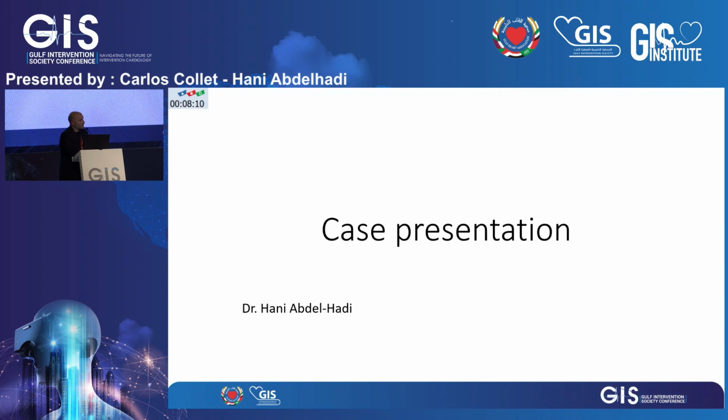People who have no experience of DCB, it's difficult for them to talk about it because they've maybe seen it or heard about it. But if you've done this on your patients, especially the diffuse atherosclerosis you've spoken about, and you've seen the results in 3 months, this is my immediate outcome: the angina is resolving, at least in my follow-up patients. I'm just talking about CCS. So maybe, I'm not saying this is the answer, I'm saying maybe this is a better answer for diffuse disease. We should not say intervention is not the answer for diffuse disease. Maybe the DES is not the answer. I'm just provoking thoughts, because this is what I've seen, at least in my practice.